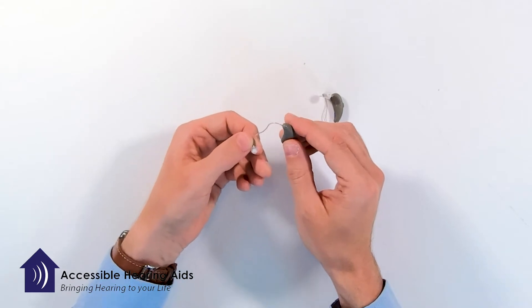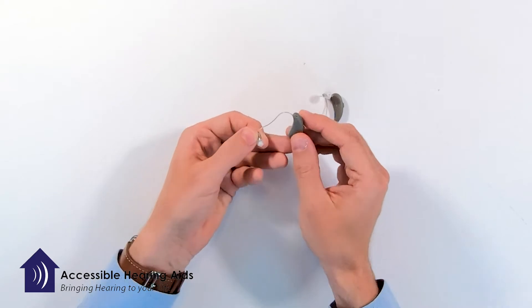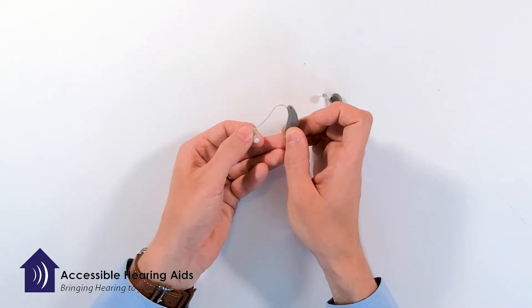You put one hand on the receiver, one hand on the body of the hearing device and kind of separate them. It should show a bit of a loop and that loop is going to be where your ear fits.